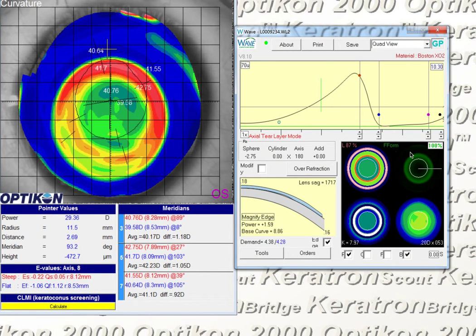This is the lens that the patient is currently wearing, and if we look through the different meridians, this Arsene lens lines up really well on this fairly symmetrical cornea. If we look at the posterior topography, we're getting lots of blue around the periphery, but it's a little bit loose inferiorly. And we do have a little bit of a ring right here where we can see it's pretty flat. So I think this lens is fitting kind of tight superiorly, a little bit loose inferiorly, and that's causing the lens to be squeezed downward.